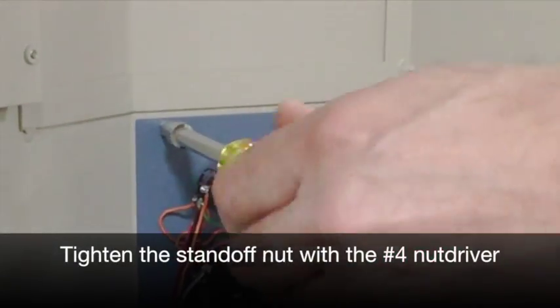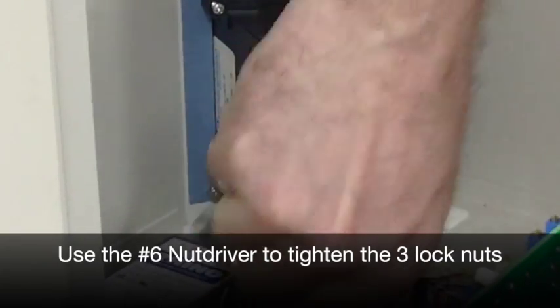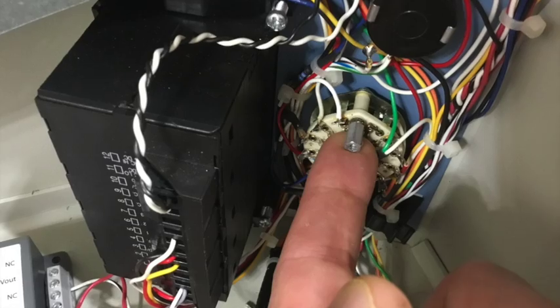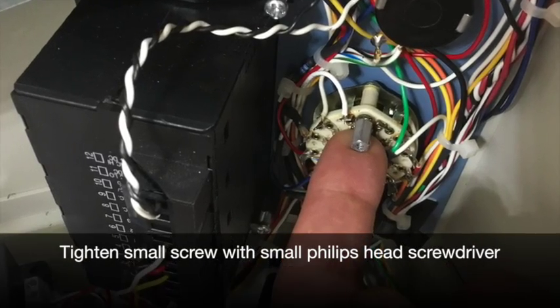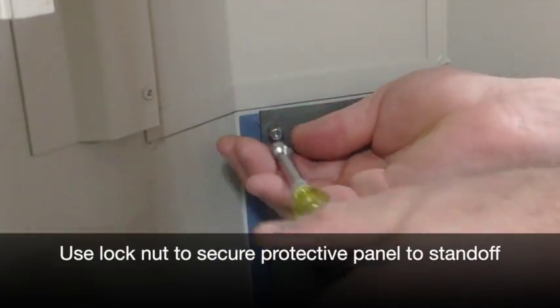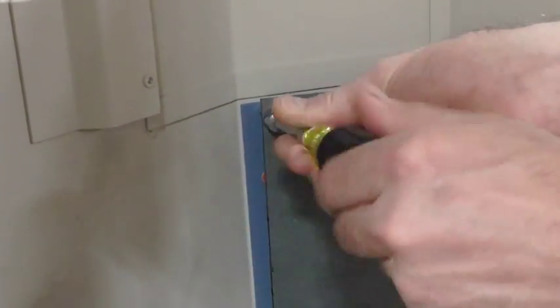Tighten the standoff screw with the number 4 nut driver. Use the number 6 nut driver to tighten the other 3 lock nuts. Line up the corner hole on the protective cover to the standoff. Line up the other hole with the small standoff on the switch, and then use the small screwdriver with a small screw to screw it in. Using the number 6 nut driver, screw in your lock nut to the upper left-hand standoff.